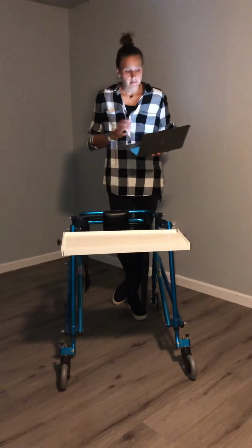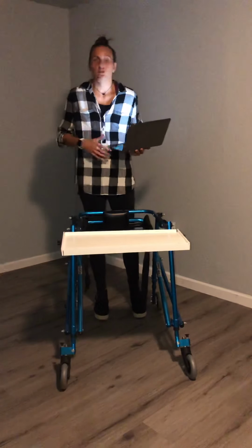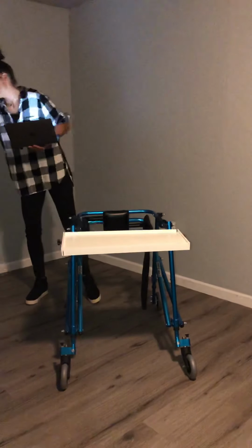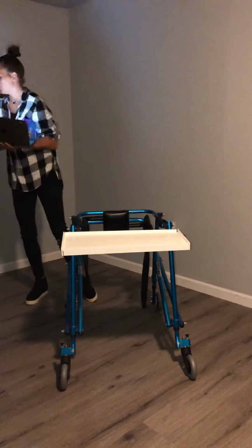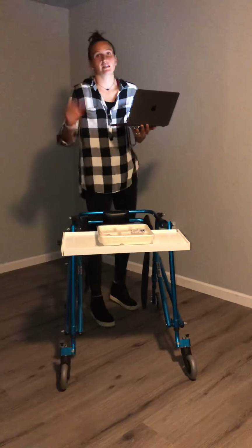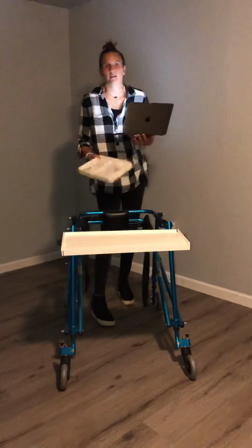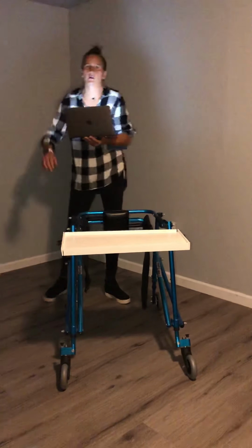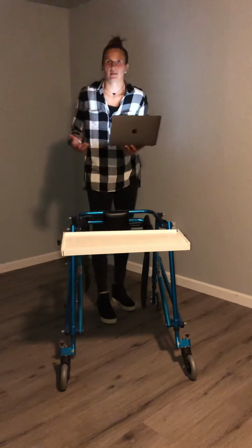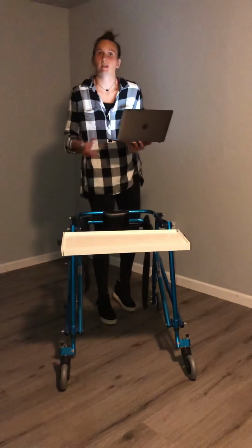So I named it the dual purpose tray or the dual purpose desk because it can be utilized for more than one purpose. If a child is at school and they're going through the lunch line, they can now put their lunch tray here on the desk or the tray, and they can go through the lunch line and do it all independently without any assistance. And I know that before, when they're having to be so dependent on people, that can probably lower their self-esteem because their peers could be making fun of them, or they might feel insignificant towards their peers because they can't do that by themselves. But now with this dual-purpose tray, they can do that.